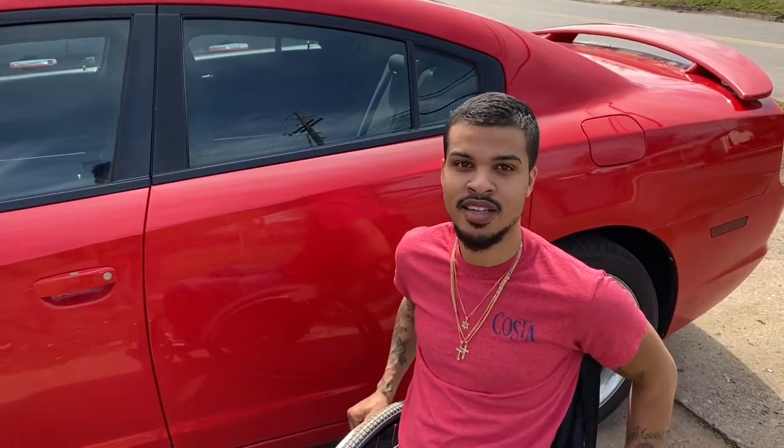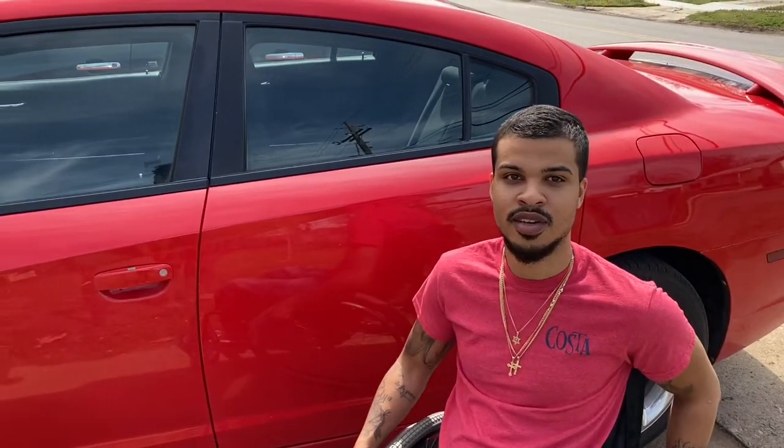Hey, what's up y'all? It's a nice day out here today. So I'm gonna show you guys how I get in and out the car whenever I get ready to drive. This is just the way that works best for me. For anybody that's in a wheelchair and trying to get used to getting in and out of the car, I'm gonna show you how I do it and how it works best for me.